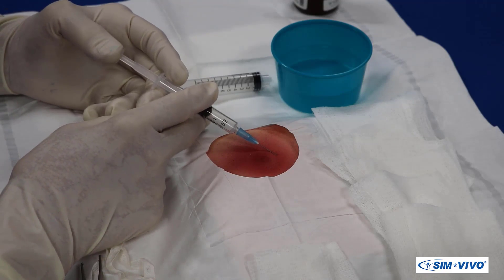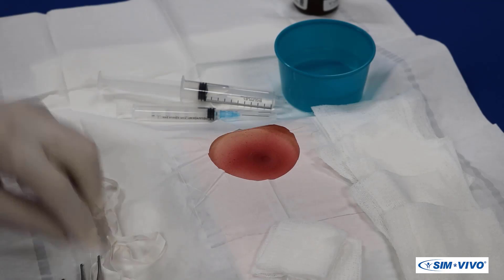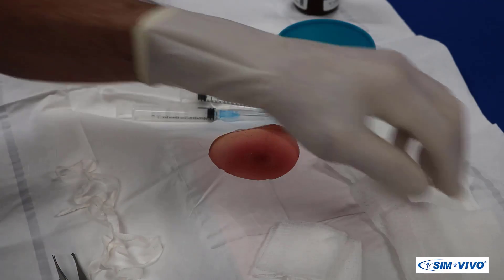Sequentially infiltrate the skin around the abscess. For convenience later, arrange all supplies and instruments for easy access.